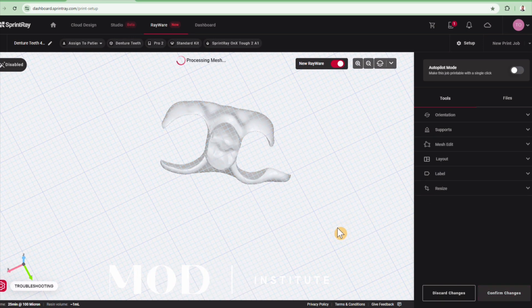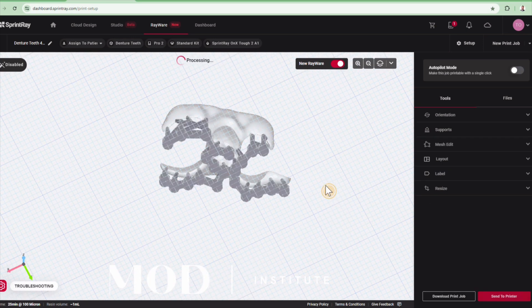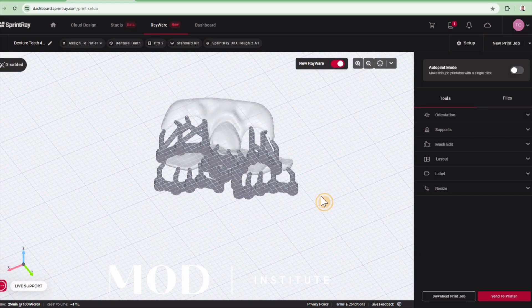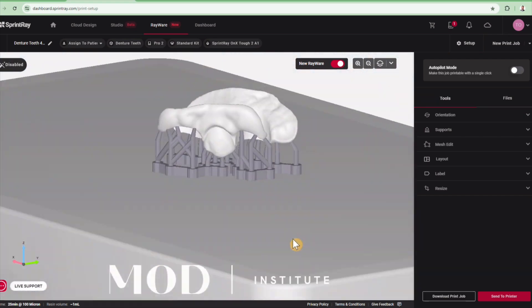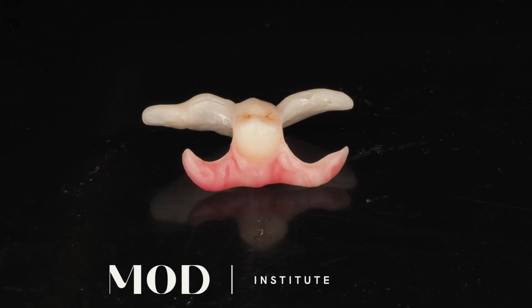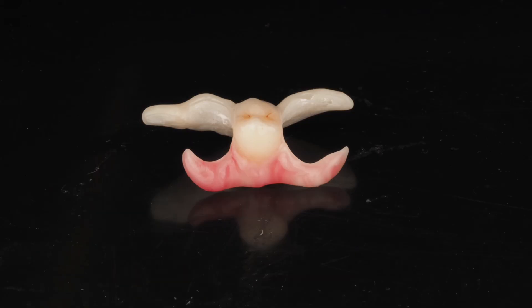I hope this helps. Monolithic partial dentures are very easy to do — it's about a five-minute design. And as you can see, it is something that can be delegated and is super fun to do for your patients.